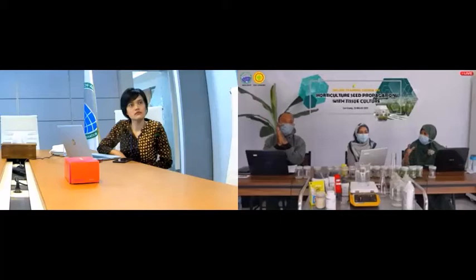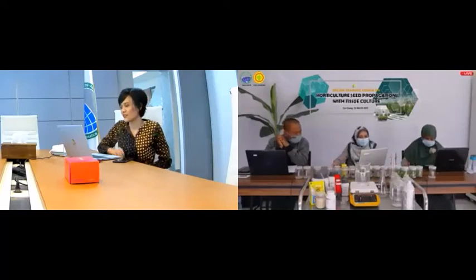Okay. You can make sure of the humidity or temperature in the incubation room. We have to make sure the temperature is not too hot, so that bacteria or fungi cannot grow into the media. So we have to arrange the conditions of the room, especially the incubation room. Yes, that's why we use air conditioning and also devices to control the humidity of the incubation room. Okay, thank you very much.